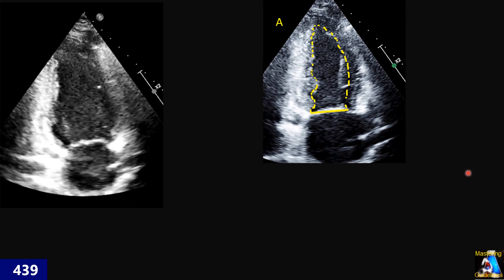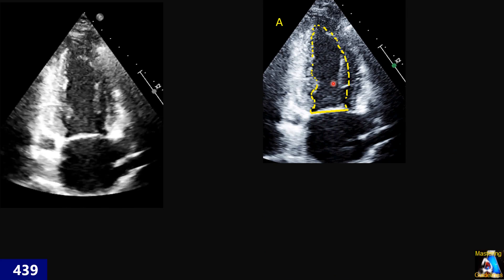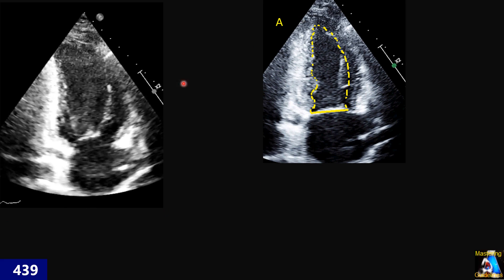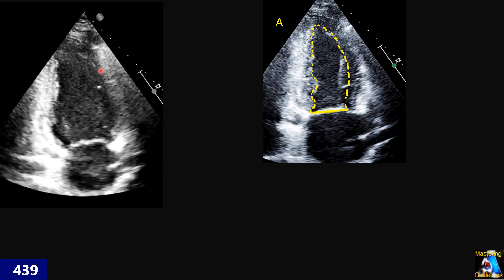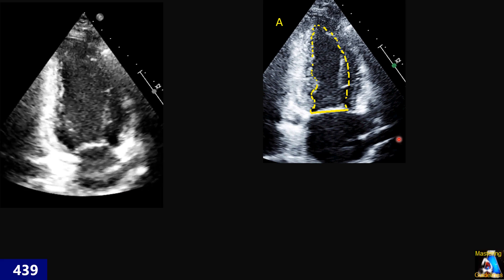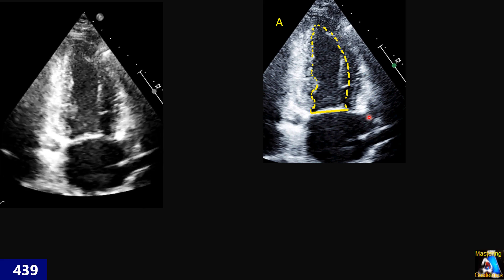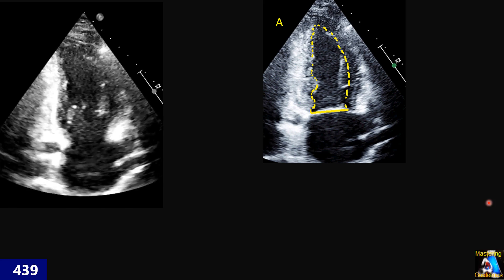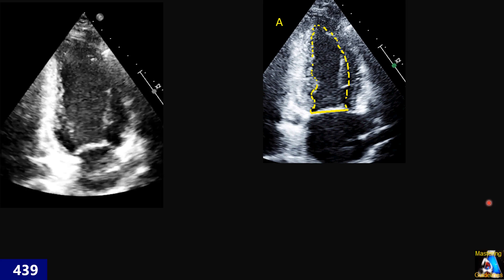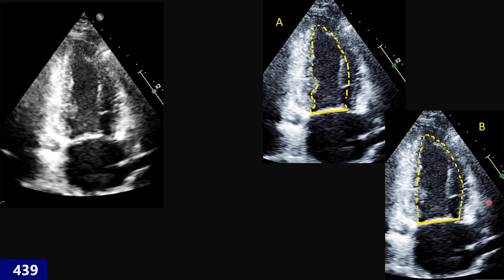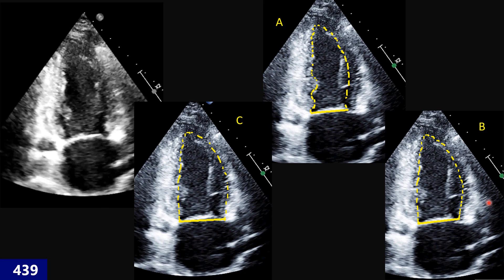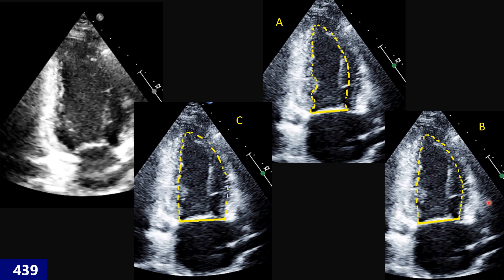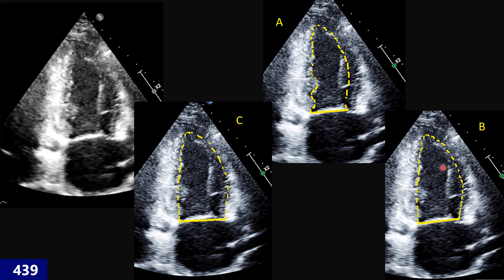After finding the correct timing for end-diastole and end-systole, here we have the end-systolic frame. Which one is correct for the tracing of the endocardium for Simpson's method? All of these tracings are at the same moment and same frame — is this one correct, this one, or this one? And what is your reasoning and criteria for selecting the correct tracing?